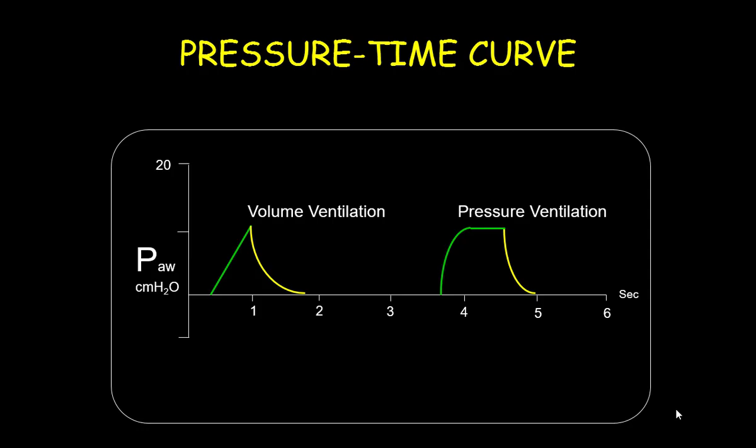I have already commented about this, why the rise is so sharp in a volume time and why it is so gentle in a pressure time waveform.